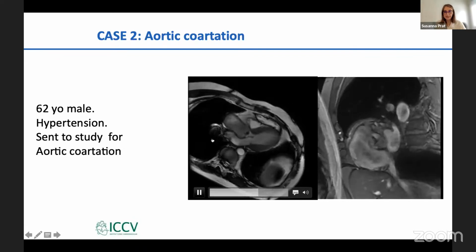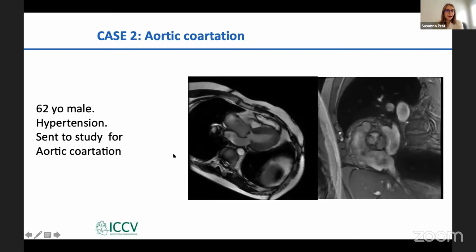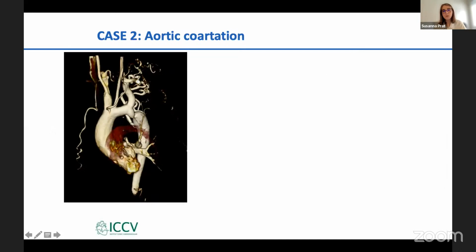The patient had aortic stenosis, and we performed as well an angiography, MRA. If we apply the 4D flow as well, it lets us measure different flows at different levels in the aortic coarctation. Usually we go here, we go before the coarctation, after the coarctation.